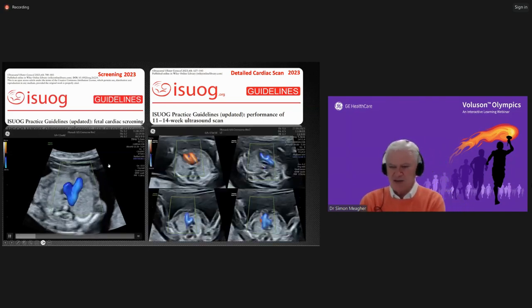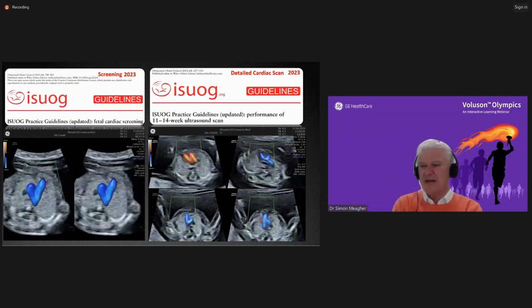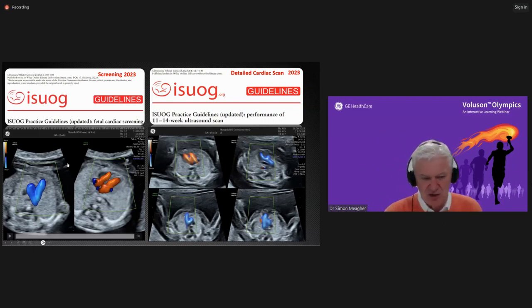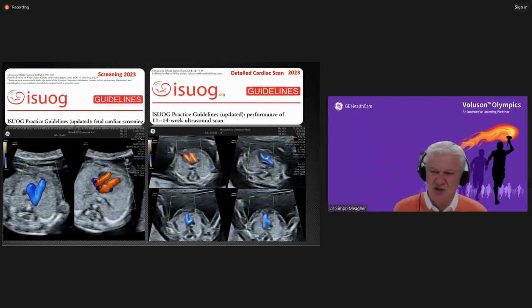If you are out there practicing, you're saying, I'm not a high risk fetal echocardiogram assessment person. I'm somebody out there who just wants to make sure that the baby I'm scanning is normal. Well, if you are, this is what you need to do. You need to provide a split image, or a cine loop image, showing a 4-chamber view of the heart and a 3-vessel tracheal view. Because if you show that image, you have excluded the vast majority of major structural cardiac malformation. It's such an important image.